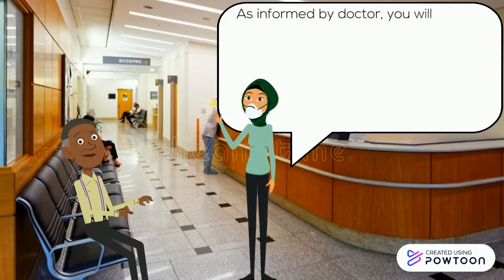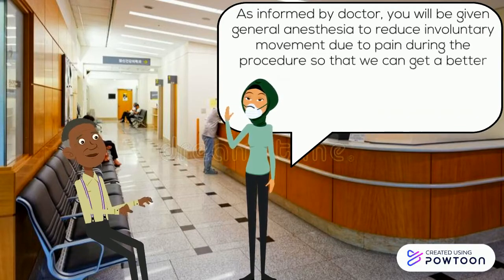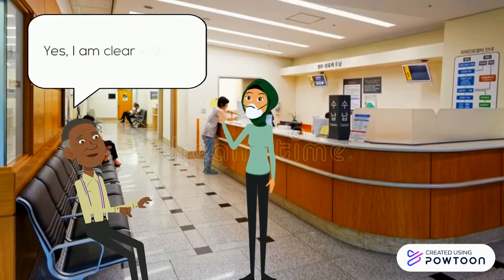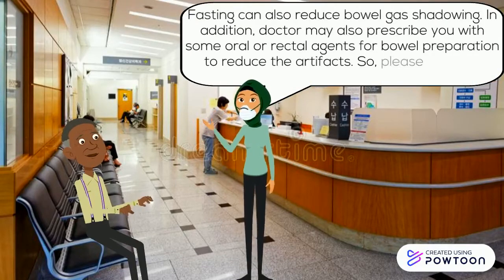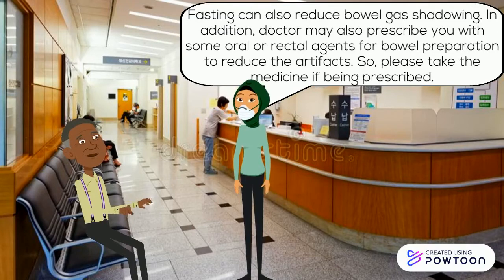As informed by the doctor, you will be given general anesthesia to reduce involuntary movement due to pain during the procedure so that we can get a better quality of images. So, you are required to fast for 12 hours before the procedure to reduce the risk of aspiration. Are you clear with that? Yes, I am clear with that. Fasting can also reduce bowel gas shadowing. In addition, the doctor may also prescribe you some oral or rectal agents for bowel preparation to reduce the artifacts. So, please take the medicine if prescribed.